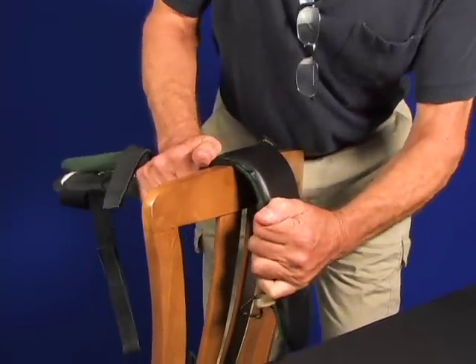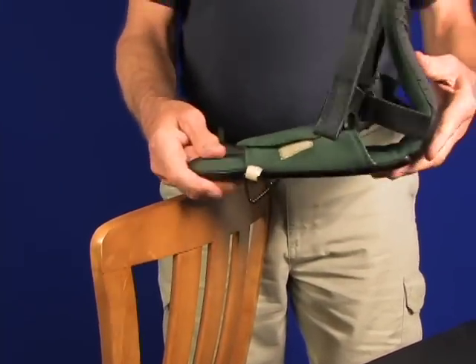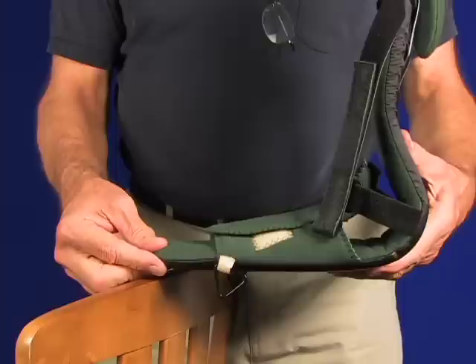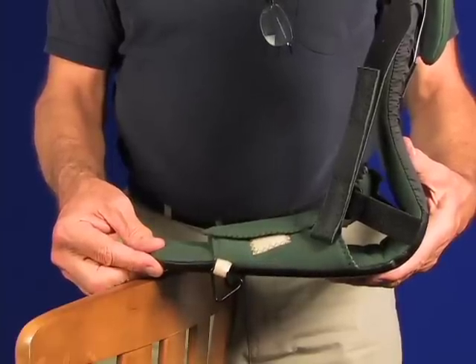Use a chair back or a table and put small bends into the heel area until you get that 90-degree angle back in place. You can see that the small bends have shortened the foot part to accommodate a smaller foot.